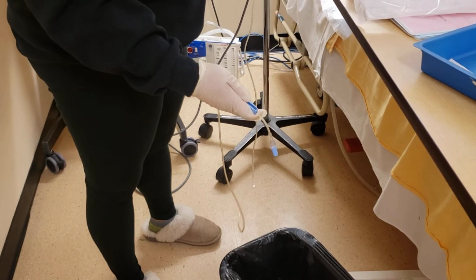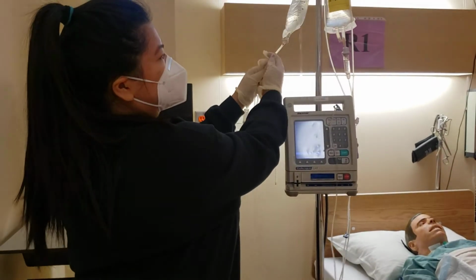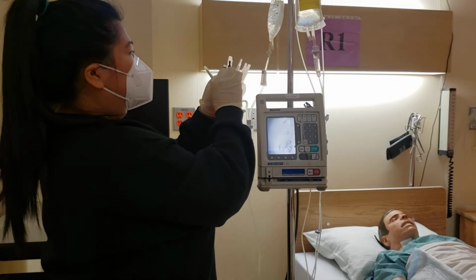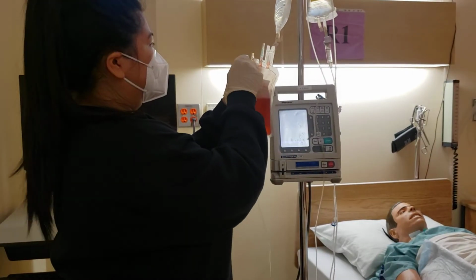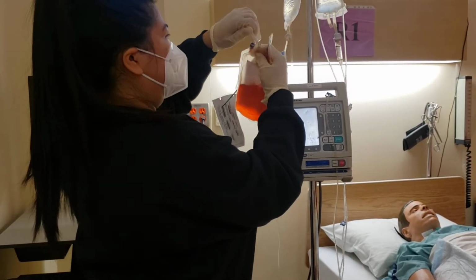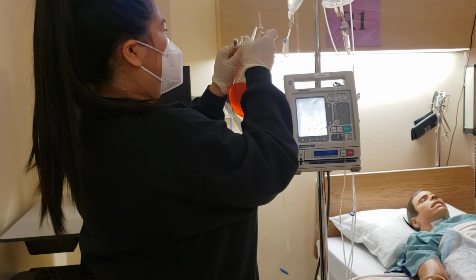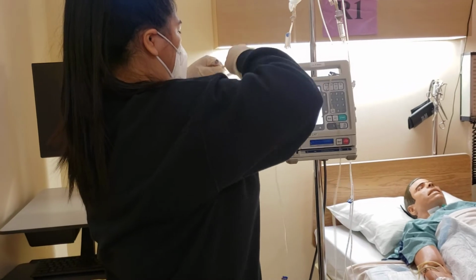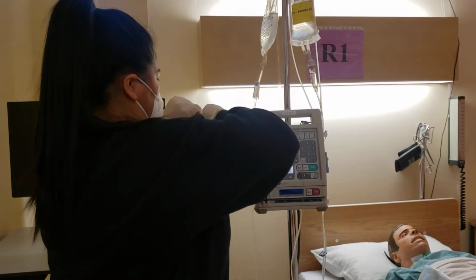It was ordered today, so we're giving it now. After that, we will make sure the clamp to the normal saline is closed, and then we will spike our blood bag. After that, I can go ahead and inject my medication into the normal saline. I'm just going to swab my port for 30 seconds and let it dry, and after that I'm going to inject my 1 ml insulin.